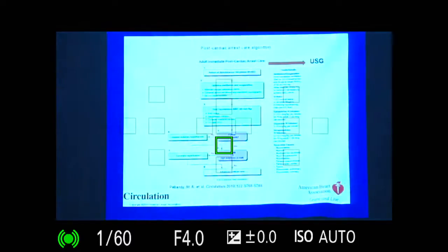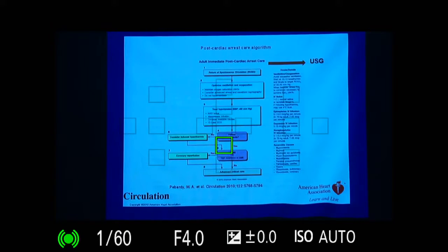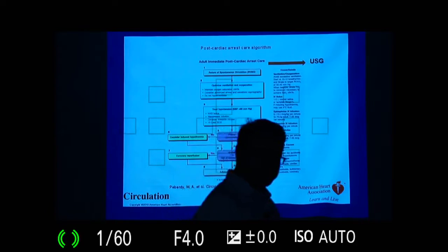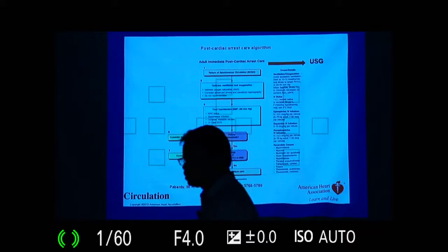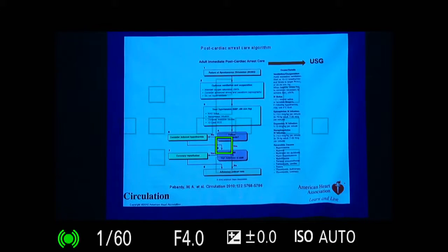Once there is return of circulation, you can use it as an adjunct in the ABCD protocol again, because sometimes you may have dislodged the tube. You can check the tube again, and you may have created a pneumothorax, so rule it out again. Now you can do a more detailed hemodynamic assessment. You can calculate indices like the collapsibility index, distensibility index, and velocity time integral. That is slightly higher-level work you can do after return of circulation, and you can find out why the patient arrested in a detailed study in the tertiary survey. Understood?